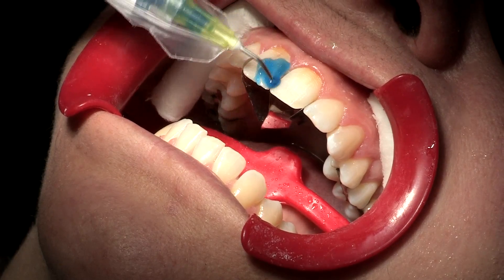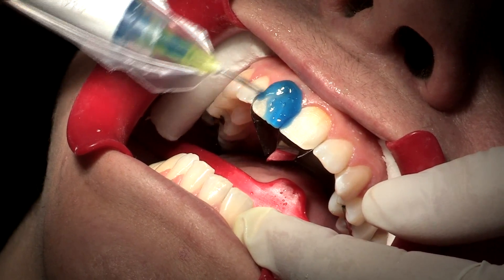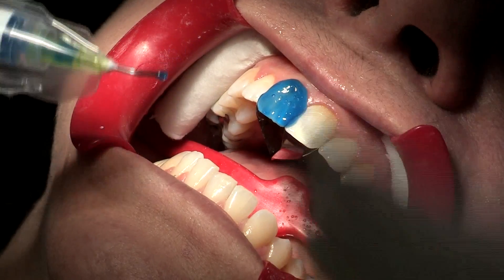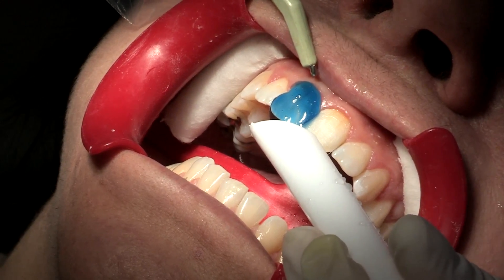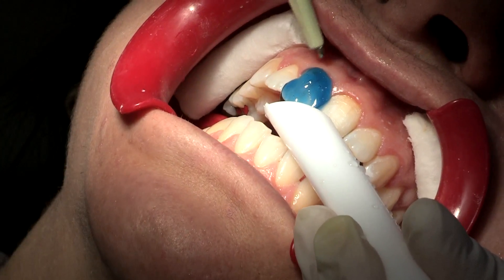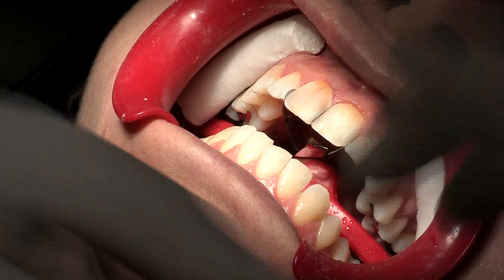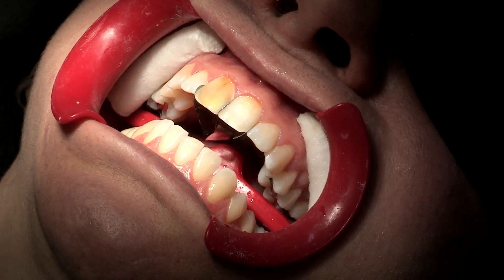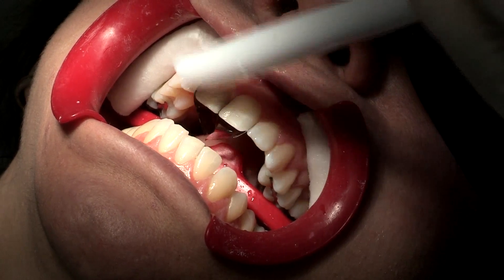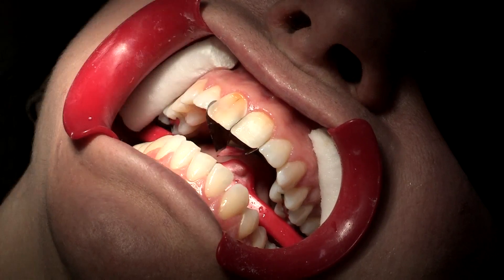Now we're going to etch the tooth and we're going to work one tooth at a time. I'll leave the etch for 10 seconds. And then I put my bond — we apply the bond, rub it a little bit, then we suck it, and we light cure for 20 seconds.